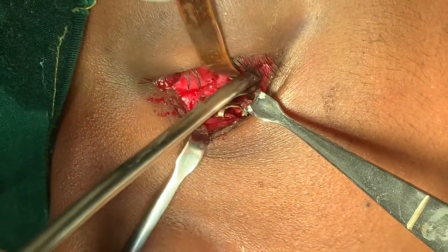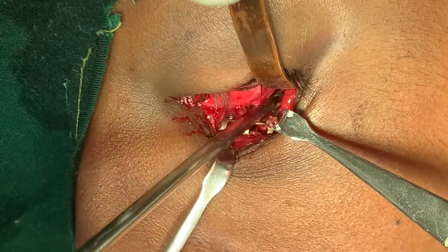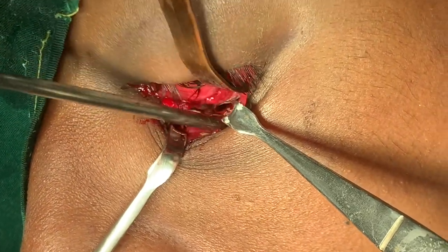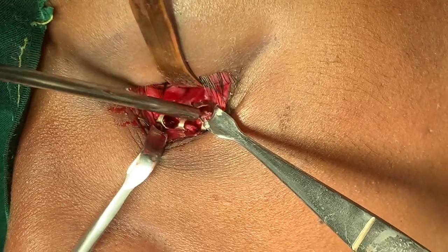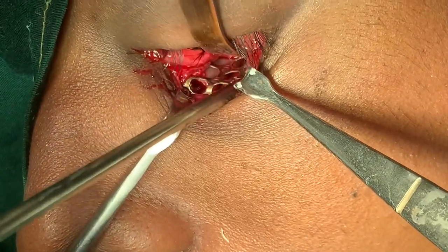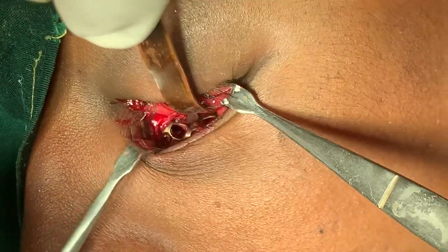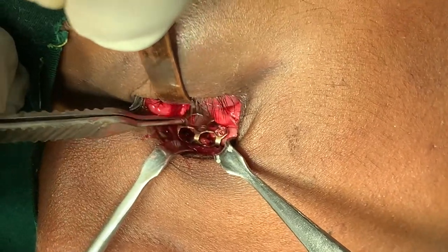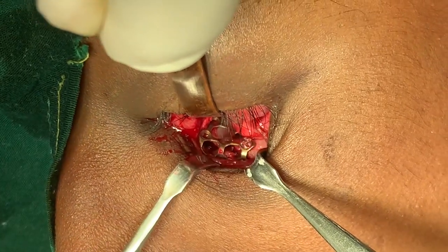And this implant is bridging. I've actually fastened it myself. Same curvature both sides. And here I've made it bend like the infraorbital rim. Can you see that? The patient can't feel it. It's just the normal anatomy that you've readapted. No computer, CAD CAM, nothing. But this is being done with a mesh. And this is because you have the anatomy that's available. And this is going to solve the problem of any enophthalmos the patient might develop.